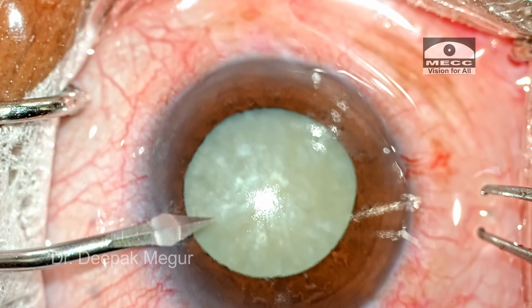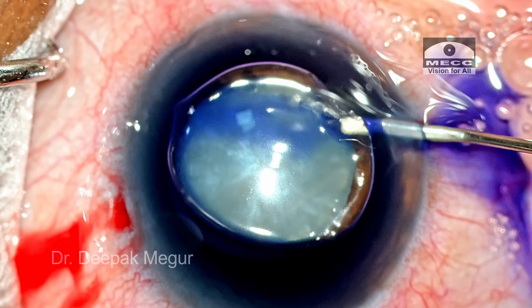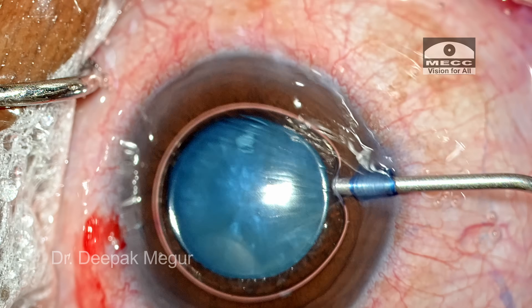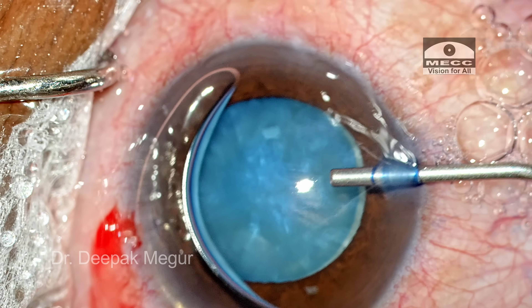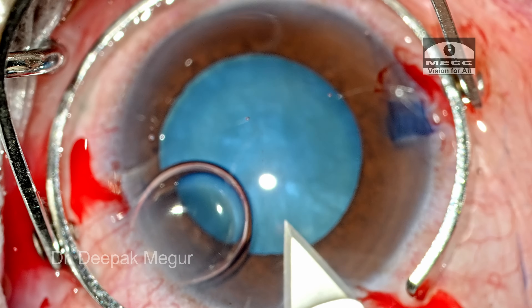As usual we make the side ports, fill the chamber with air, and stain with trypan blue under the air bubble so that we get good staining of the anterior capsule. It is then refilled with dispersive OVD. I am using a mixture of chondroitin sulfate and sodium hyaluronate to maintain the chamber.